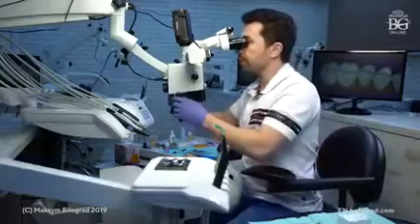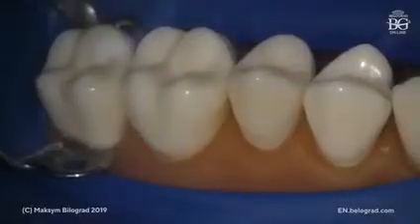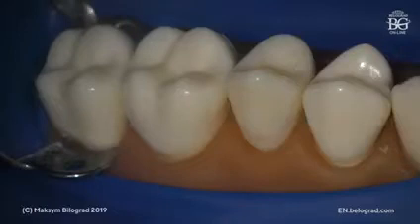Let us assume that this is a case when a patient comes for aesthetic and functional rehabilitation, and he or she would like to get teeth whiter, and we would like to improve the aesthetic outcome of the patient's smile. We have to discuss everything with the dental technician before we start the case, because the one who is responsible for color change is our dental technician. You have to provide your dental technician enough information to understand the initial situation and also what kind of outcome you would like to achieve as the final result.